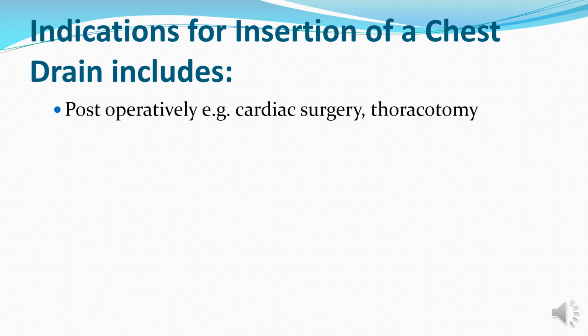The second one, post-operative, is thoracotomy. What is thoracotomy? Thoracotomy is simply the opening of the thoracic cavity or the chest cavity. So as long as it's any operation involving the opening or the cutting through the chest cavity, you need to put in underwater seal drainage so that you protect air from going inside, as well as fluids, so that you avoid fluids from accumulating in the area around the heart or around the lungs. Very important, especially after thoracotomy.